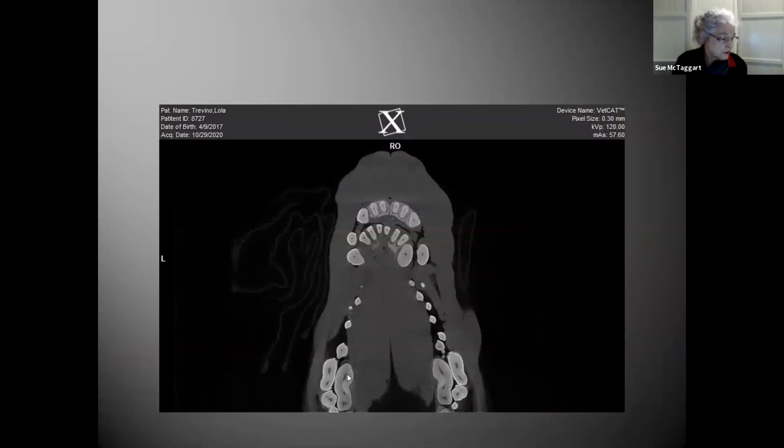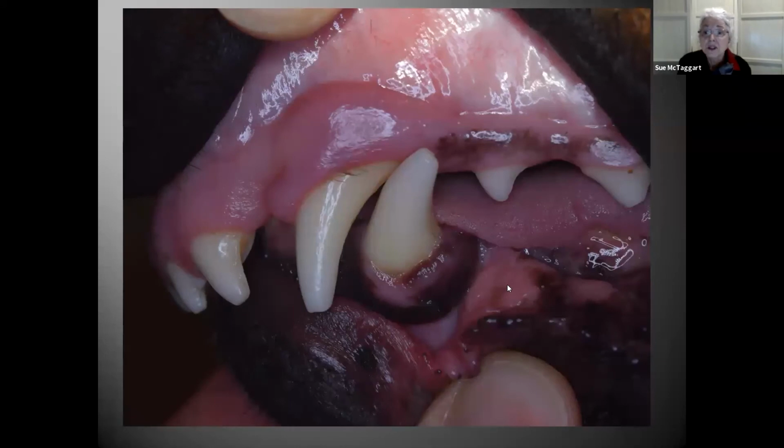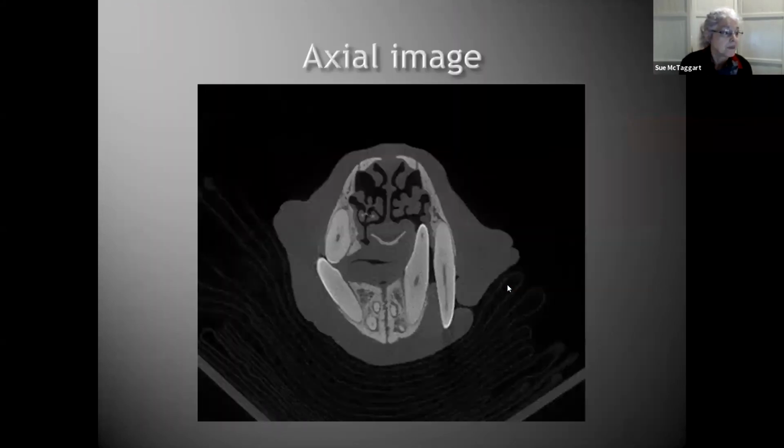So you can see this is 309 and this is 208. You can actually see on these images how they fit together. Never could do that before. So in the past, we were limited to noting rostral occlusion without the benefit of comparing right to left caudally. So here's our axial image, and it shows the true extent of palatal bone loss, which guided my flap design such that I knew where there would be underlying bone and where not.